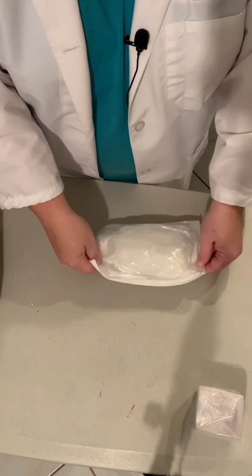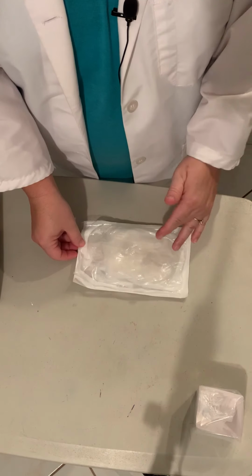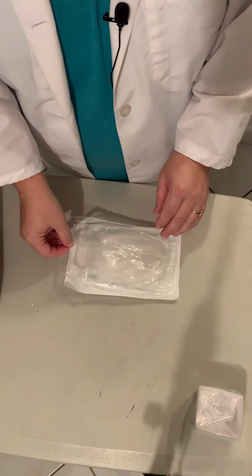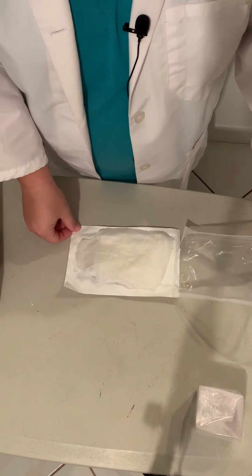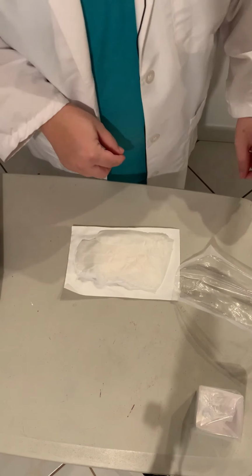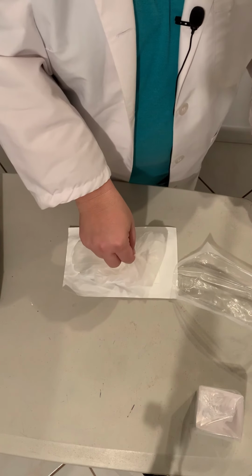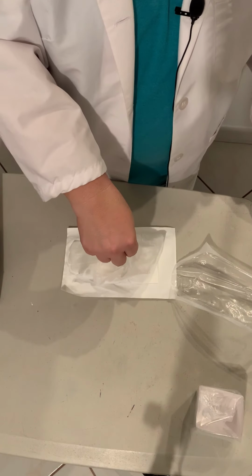So we're going to flip this over. Okay, being careful that we don't let everything slide around, because if it hits the edges, it's contaminated. So we're going to open this up, make sure it's good and open so it's going to stay. And we will pick up our first glove by the cuff and hopefully they're going to come apart.